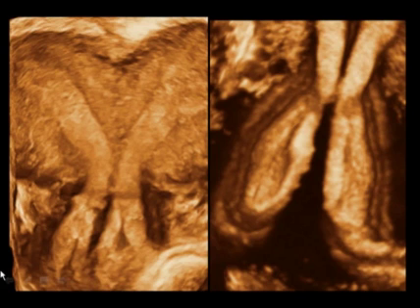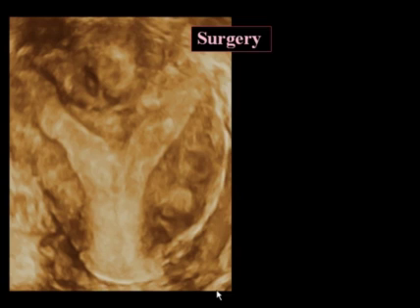And here is another example of a complex uterine shape abnormality with, at the top here, an indentation of the serosa, so this is bicornuate. It's also a complete septate uterus with two cervices. Here are the two cervices with a little bit of fluid in each cervix. So a very complex abnormality, which we can really depict very, very nicely.